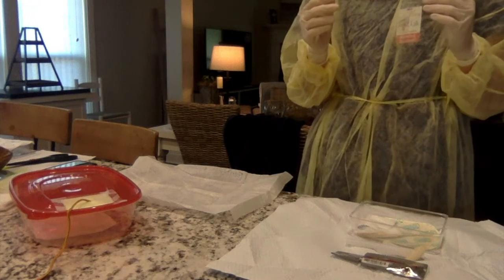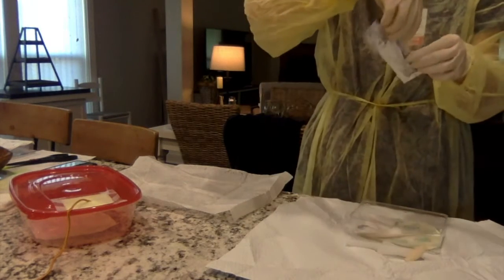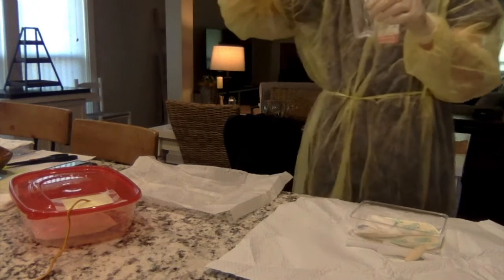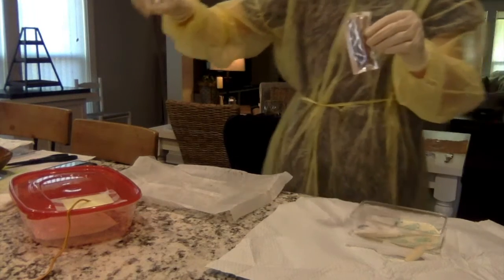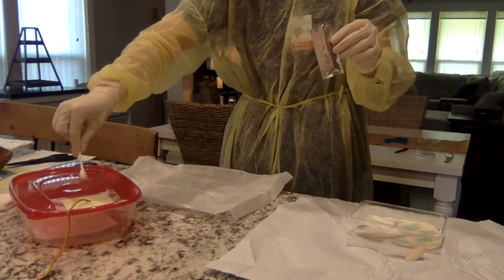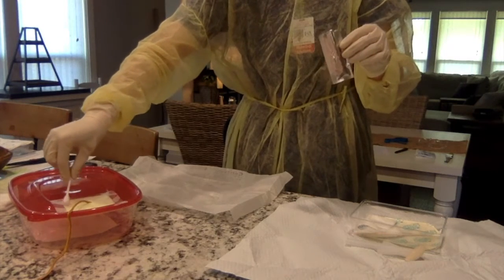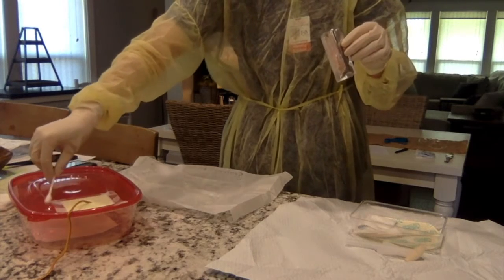So the first thing I'm going to use today is my alcohol swab stick, and I'm going to open it. And now I'm going to take my alcohol swab stick and come over to my insertion site and clean from the insertion site out, making sure that I do not cross over the same cleaning site twice.